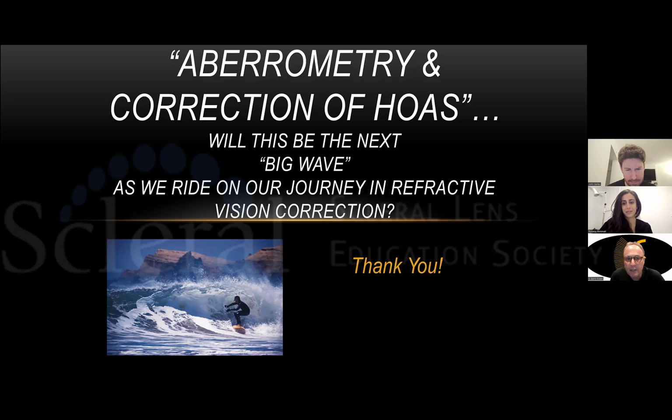Tom W. had a great question. He's worked with the Ovitz design using a specific type of scleral with mixed results due to decentration, rotation. And he was wondering if CSP-based or impression-based technologies would be something that would result in better outcomes. John is going to respond to this very clearly, but I agree. The better you can get the stability and centration of these fits before you apply that HOA correction on the anterior surface, the better your outcomes are going to be.